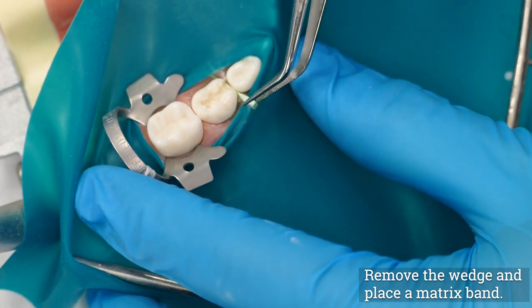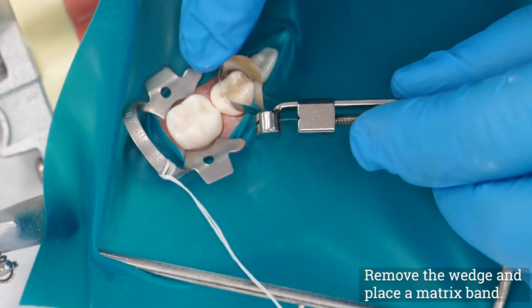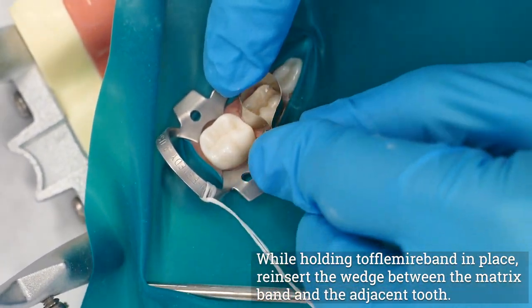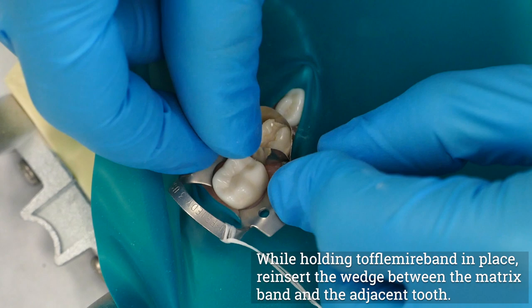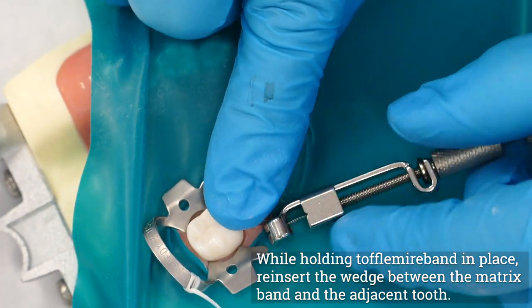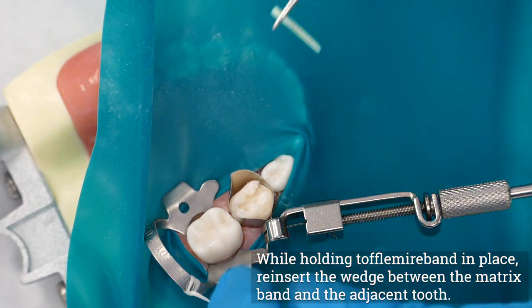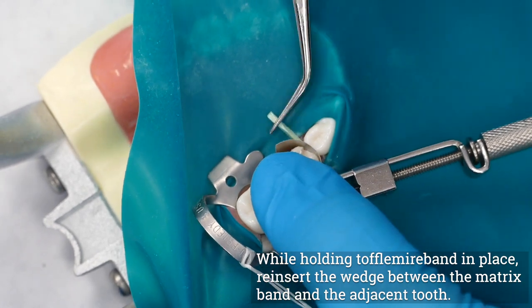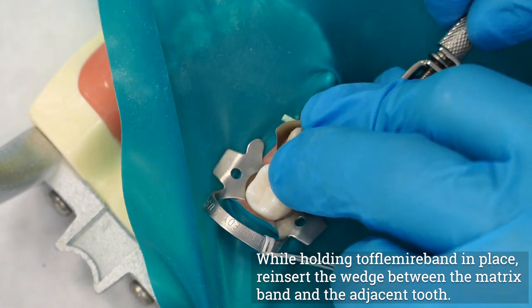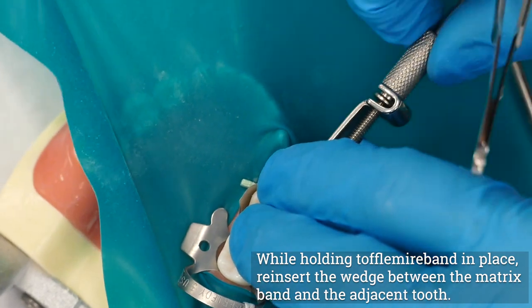Remove the wedge placed at the beginning of the treatment and place a Toffelmeyer band. Matrix bands or T-bands are alternative options to using a Toffelmeyer. While holding the band in place, forcefully reinsert the wedge between the Toffelmeyer band and the adjacent tooth beneath the gingival seat of the preparation. The wedge is placed with a pair of Howe pliers or cotton forceps from the widest embrasure. The wedge should hold the band tightly against the tooth but should not push the band into the proximal box. It may be necessary to trim the wedge slightly to achieve a proper fit.